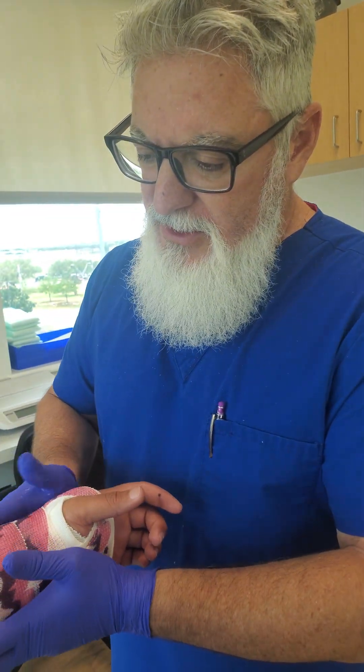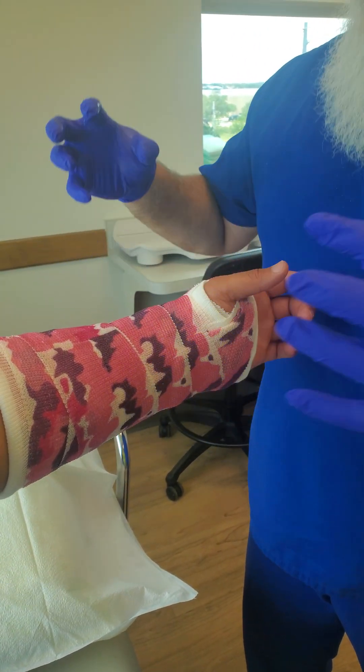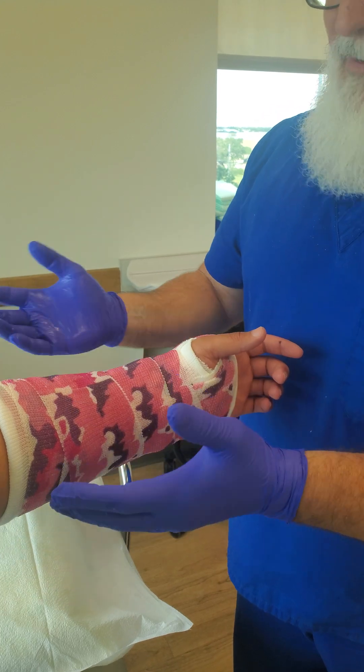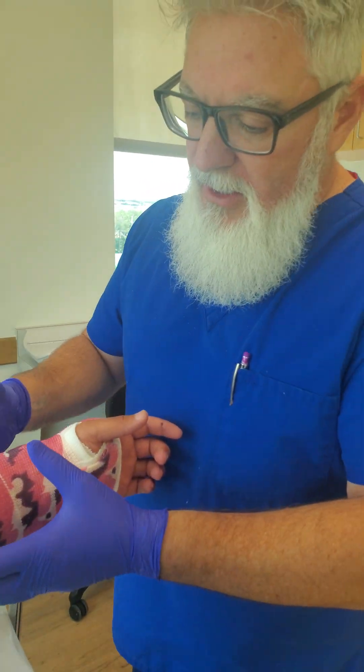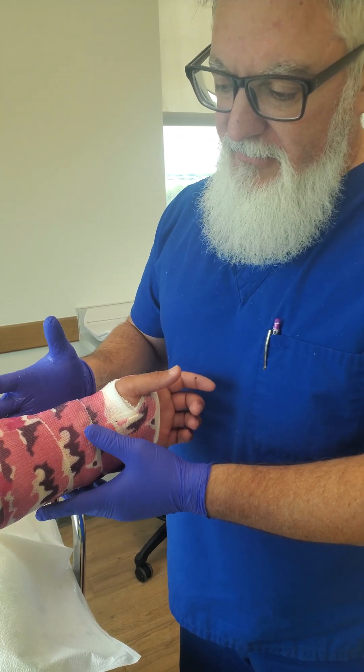Today we just finished doing a short arm cast, and if you look at it, you'll notice that I purposefully left it very cylindrical — just round — and I did that on purpose. We all know the very basic casting stuff.